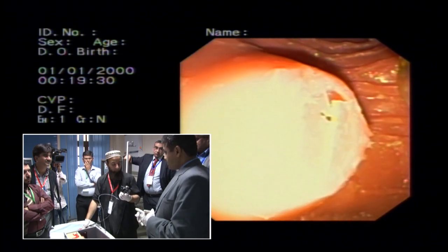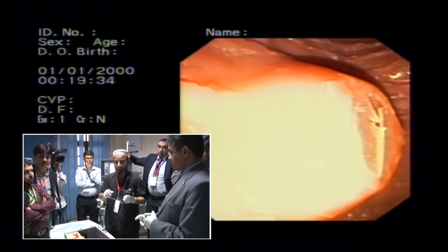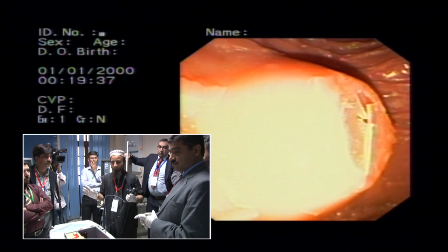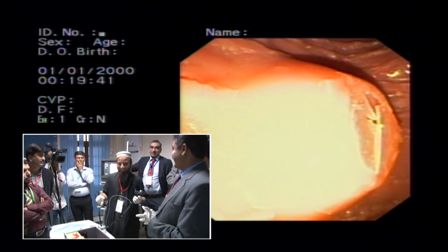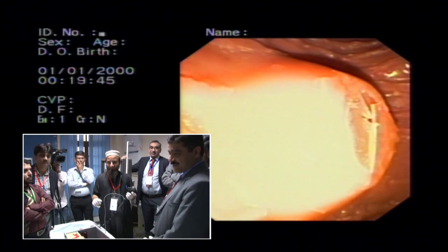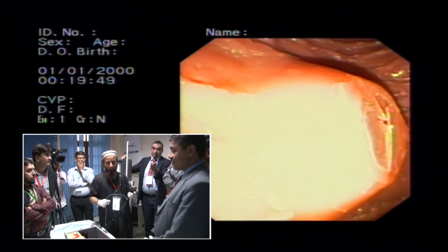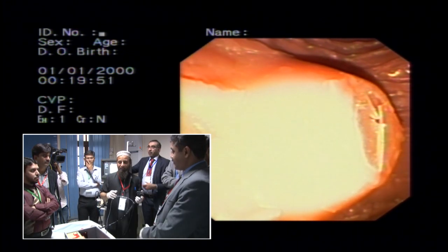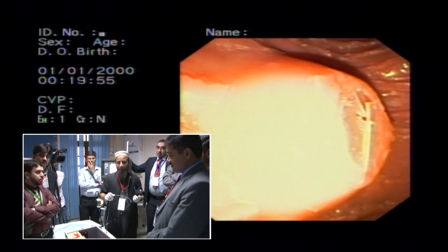मुझे ये बताएं कि इस एम्पुला को स्ट्रेट करने के लिए, अपनी तरफ सही करने के लिए what options do you have? Don't touch anything, don't do anything, I have learned it from Paul. Stop, freeze and tell me what options do you have to bring this ampulla facing Wakar? ताकि एम्पुला आपका स्ट्रेट हो जाए। आपके पास ऑप्शंस क्या है? Small wheel, okay good, what other?